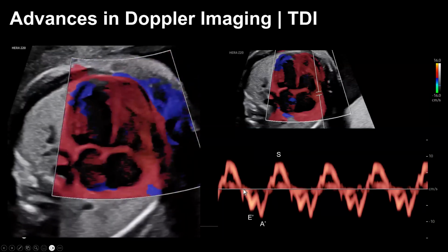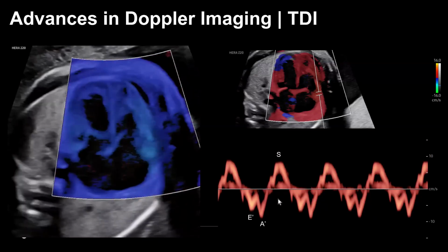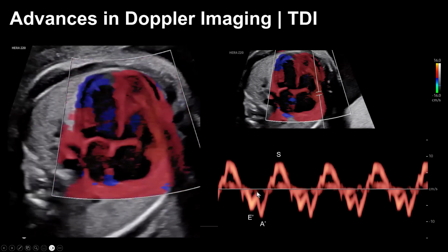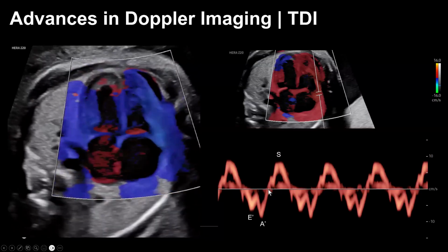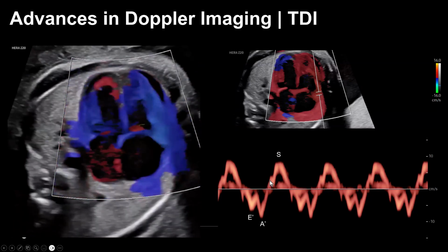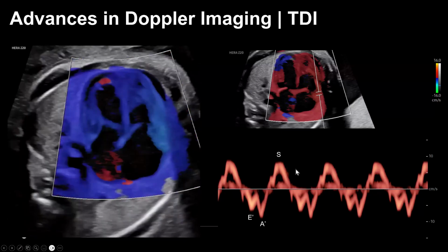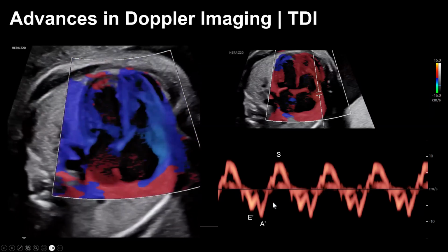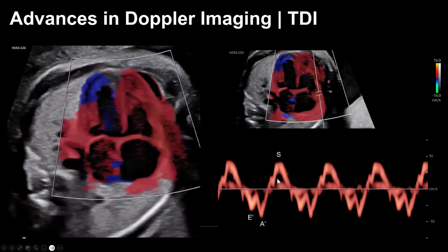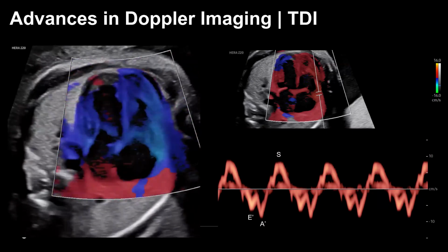So basically this curve demonstrates the myocardial velocities, not the intracardiac velocities, and they have a similar pattern. There is the myocardial movement during diastole from here to here, the early diastolic movement, and the movement of the myocardium during atrial contraction. And then there is the systolic phase where the heart is moving towards the apex, and that's why it's directed towards the probe. So looking at those cardiac cycles, you can evaluate the atrial contractions and the contractions of the ventricle, see that they are associated, and judge the rhythm.